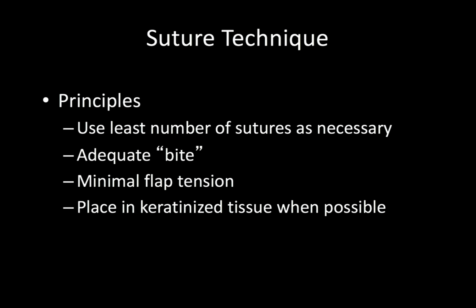There are 4 principles that we follow anytime we are suturing a site. These 4 principles are: number 1, use the least number of sutures as necessary to close the wound. This will ensure an adequate blood flow to the flap. 2, take an adequate bite of tissue.